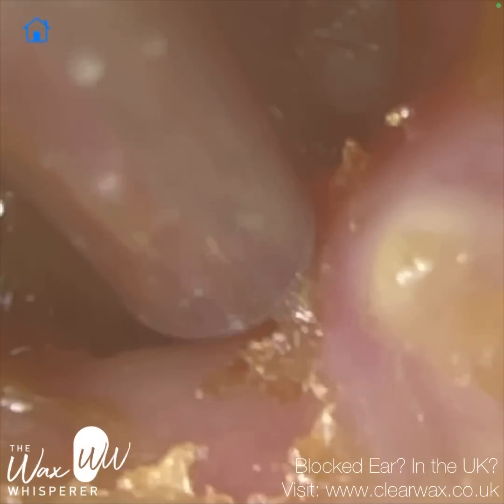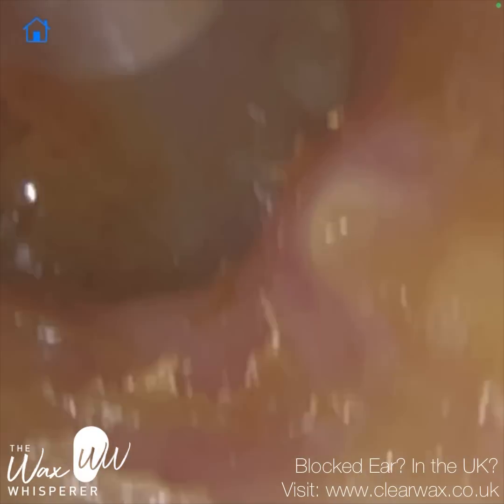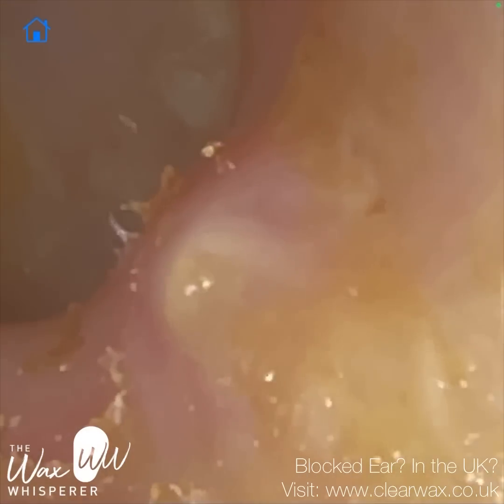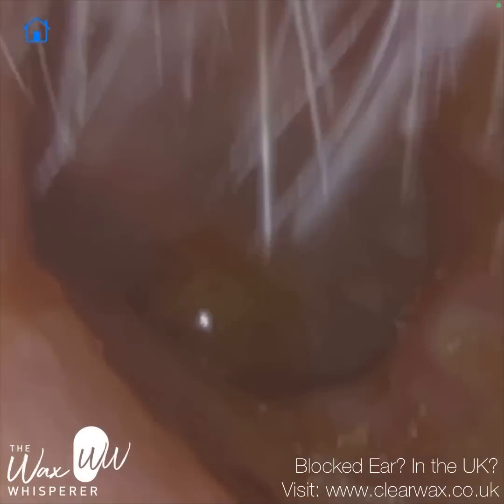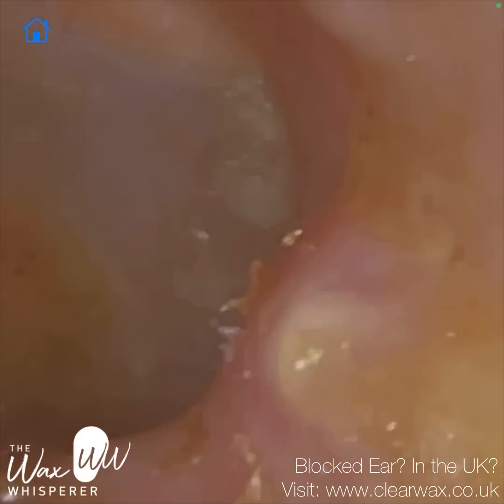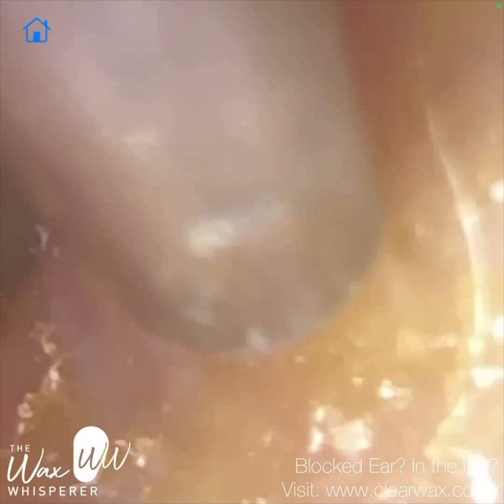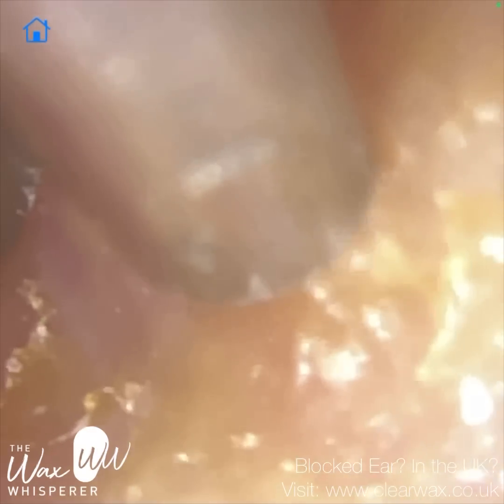Again, you can see just how careful we are. Just to the right, that's the bony protrusion. I'm just trying to hover over. Some of this dead skin isn't coming away really — it's quite sticky. But it's not going to cause the patient any problems.